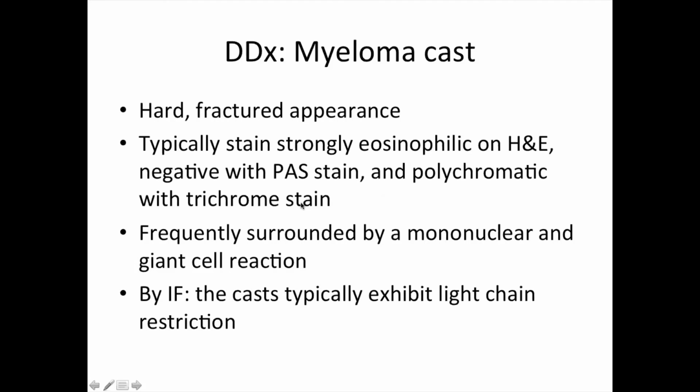لأن هم they are a mixture. طبعا هم dominant of light chains, بس هم يعني mixture of the light chains with predominance of one light chain, ويكون عندهم شوية بروتين، ويكون عندهم شوية reaction من inflammatory cells، يكونون polychromatic. يعني ما يكون المايجلوبين كاست يكونون على الترايكروم يكونون برايت ريد. هذين يصير كأنهم يعني مو كريستالز، بس تعرفون يعني واجد ألوان مختلطة بعض، يعني شوية polychromatic, so many colors at the same time. يعني شوية هني أزرق، شوية هني reddish pink، شوية هني so many colors in one cast.